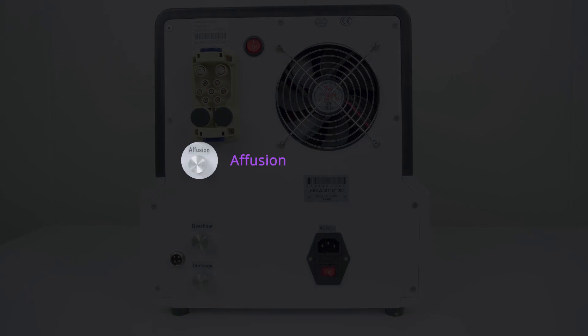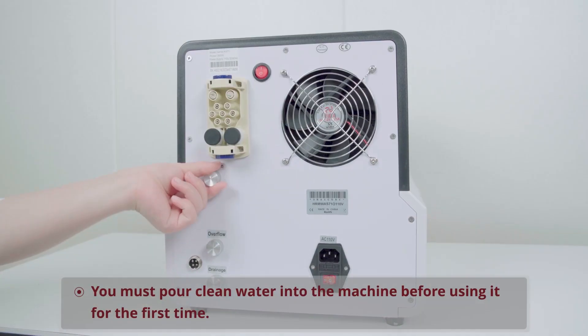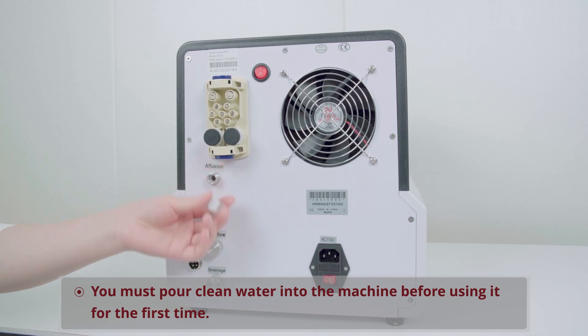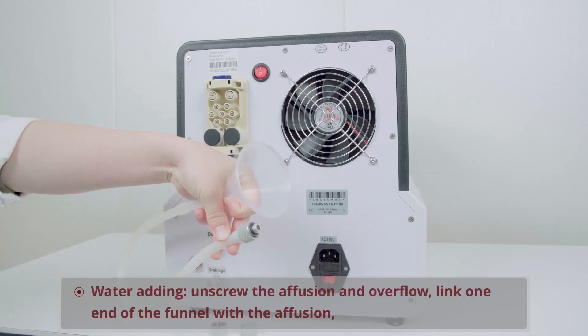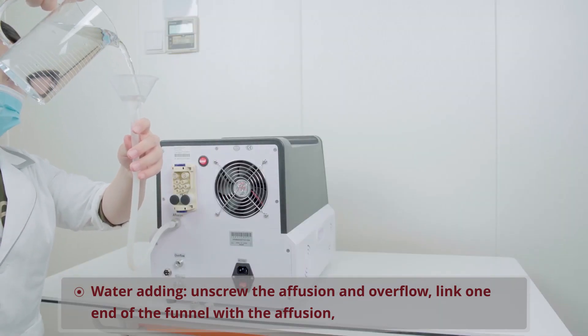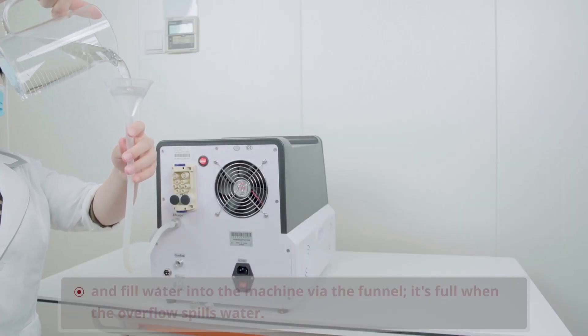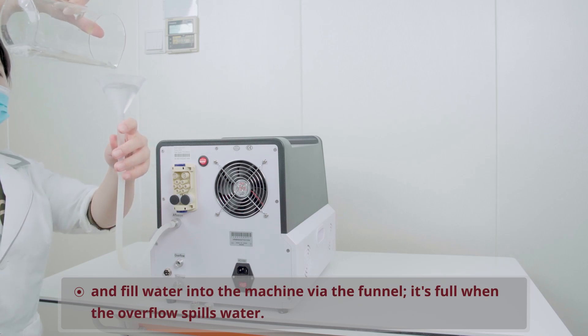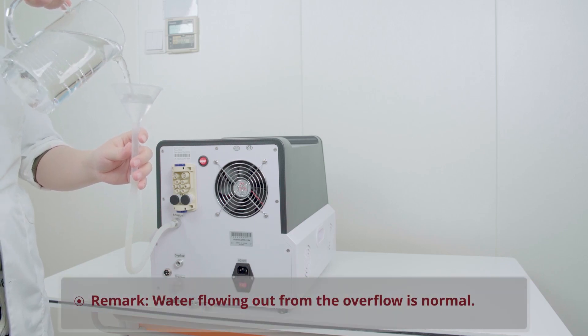From top to bottom: effusion, overflow, and drainage. You must pour clean water into the machine before using it for the first time. Water adding: unscrew the effusion and overflow, link one end of the funnel with the effusion, and fill water into the machine via the funnel. It's full when the overflow spills water. Remark: water flowing out from the overflow is normal.